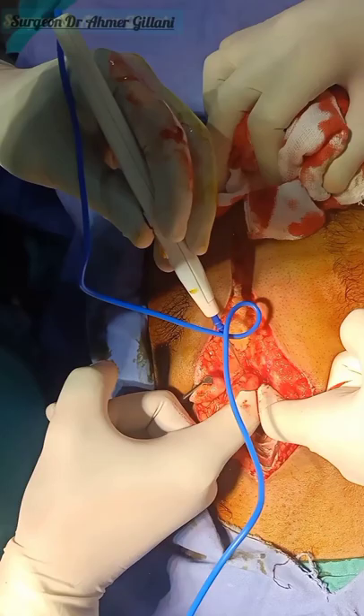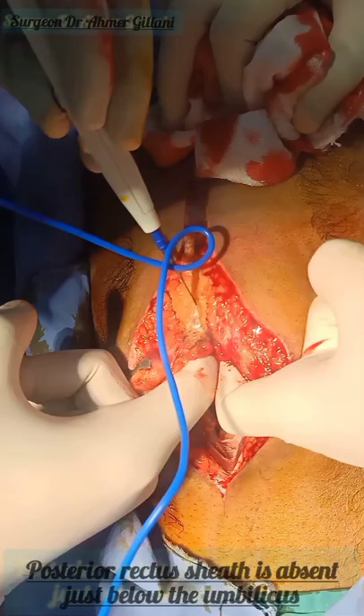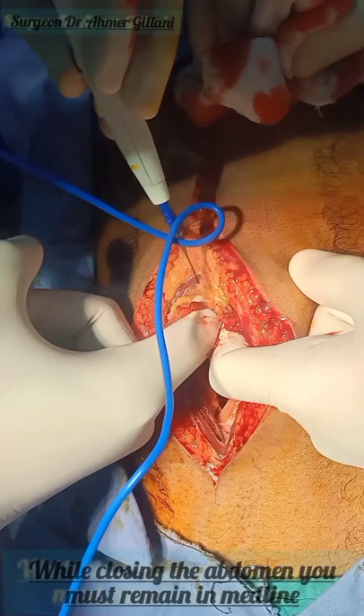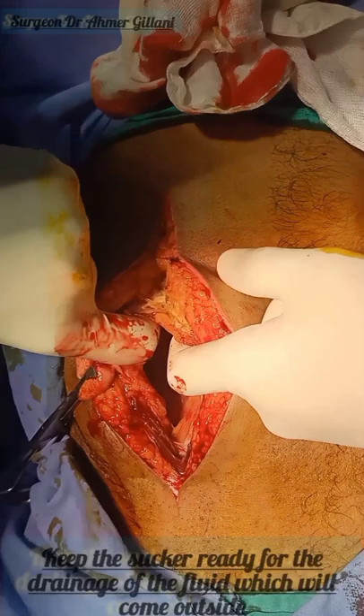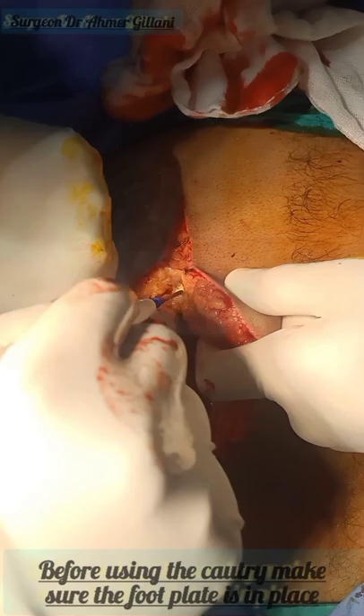You will now put two fingers and cut between your two fingers, proceeding in the upward direction. Go gentle — you should remain in the midline at all times. While using the cautery, you must make sure that the foot plate is in place; otherwise, electrical damage might occur to the patient. For safety purposes, you will use this precaution. Finally, the opening of the abdomen is almost complete.